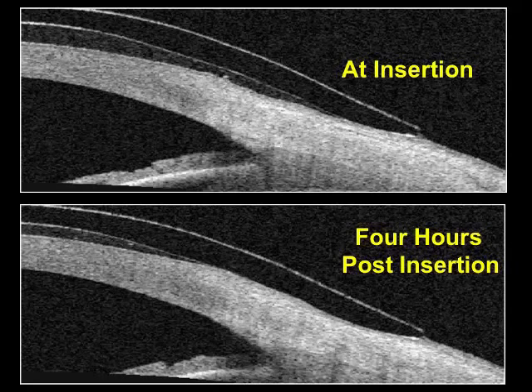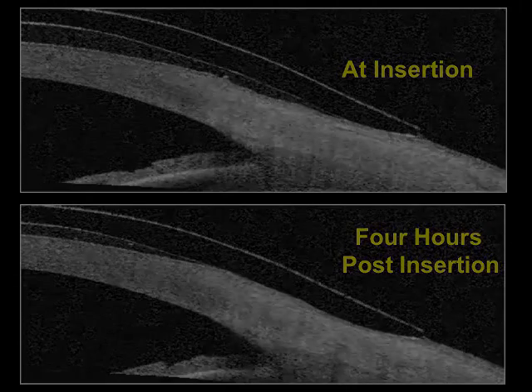So this is a case where we may want to increase the limbal clearance zone vault. Call up the lab and just order your custom order with slightly more vaulting in that area. Now it's really common to see in the central image, with the patient fixated at infinity, this thinning on the nasal side and the superior. And this has more to do with the slightly temporal, slightly inferior decentration we see in scleral lenses.